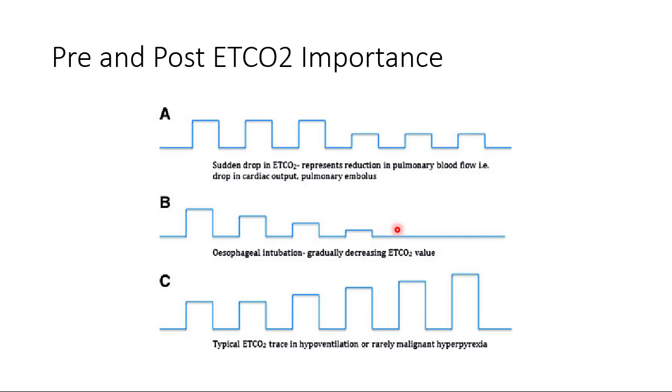So please, please, please, if you can, get end-tidal CO2 before intubation as well as after. And if you can't, don't just look at 1 or 2 ventilations and say it's good. Have somebody look at it and watch it, or you, for at least, we'll just say 6 ventilations. And not 6 rapid ventilations, 6 normal ventilations. Okay? So about 30 seconds worth. It will save your ass someday.